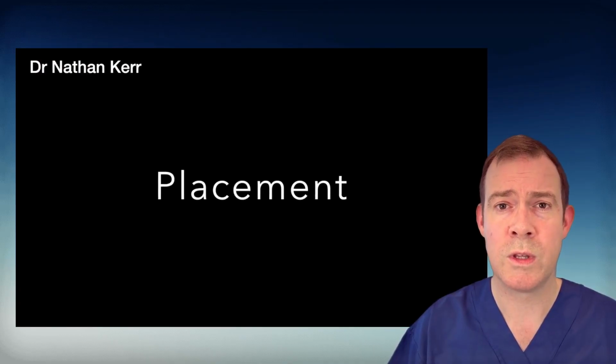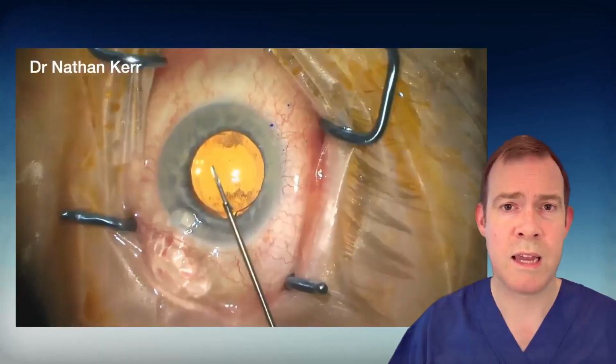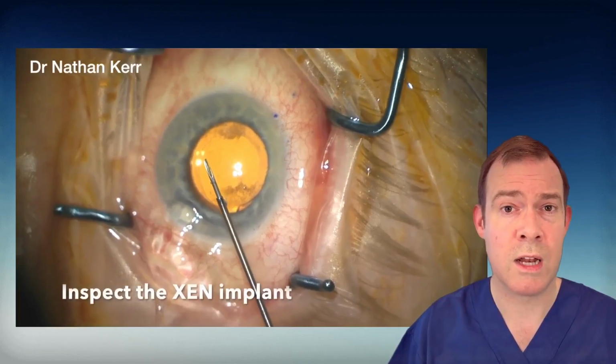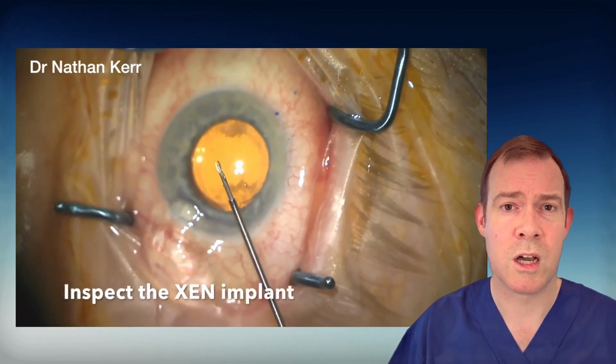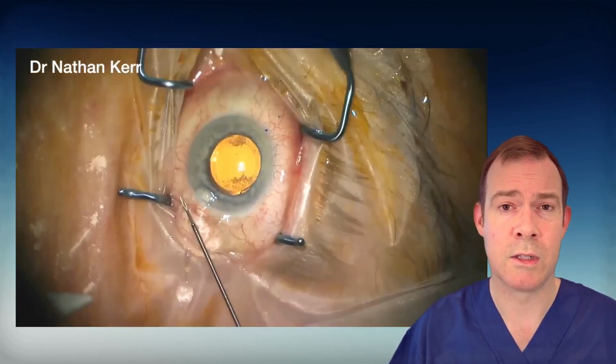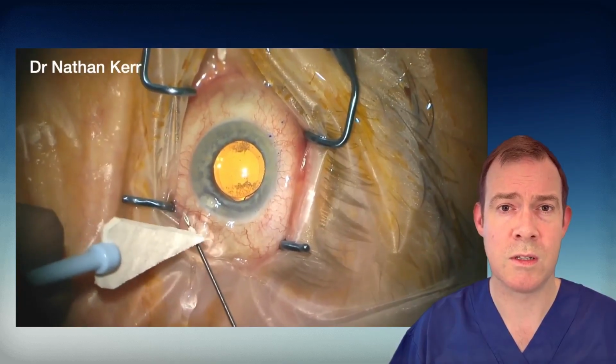We now want to ensure that the XEN is perfectly placed. Our goal is to make a connection between the anterior chamber and, when inserting ab interno, I feel, the subconjunctival space. Some surgeons aim for a subtenons placement. Here we're inspecting the XEN, it's present, it's not damaged.